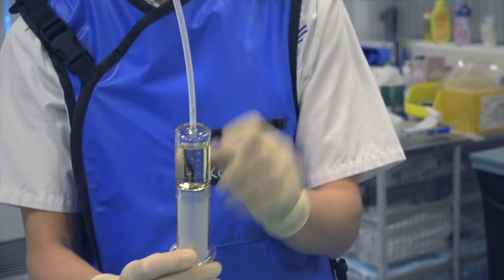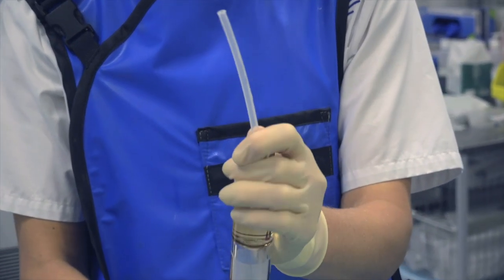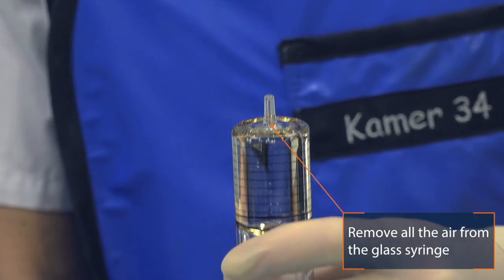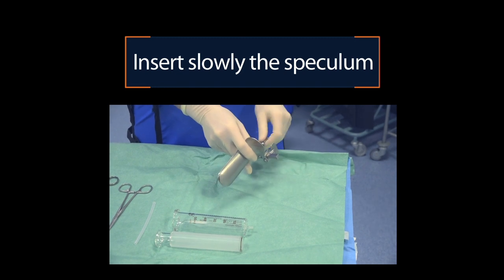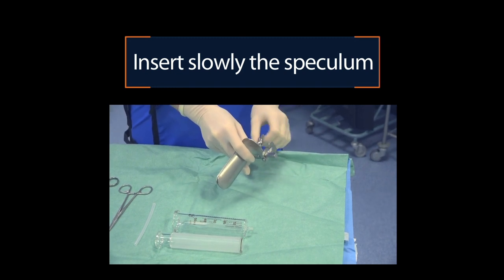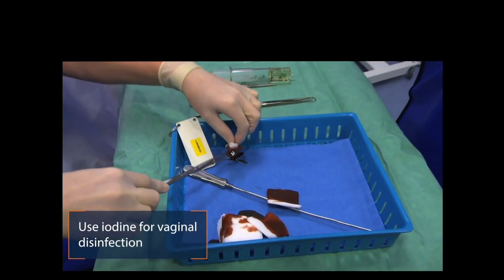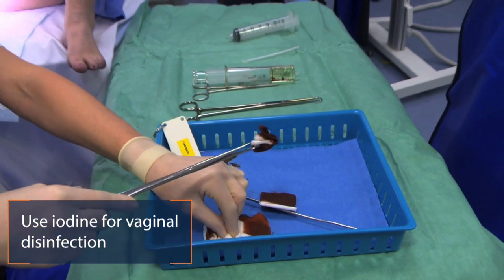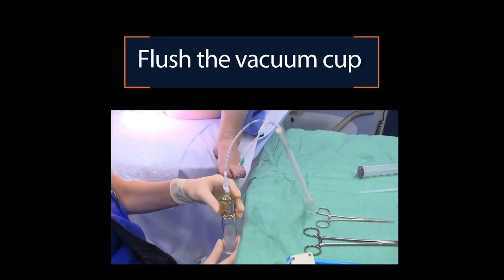Then I will get out all the air of this syringe. I will insert the speculum to visualize the cervix. I will clean the cervix a little bit before I will attach the vacuum cup on the cervix. Now I will flush the vacuum cup before I will attach it.